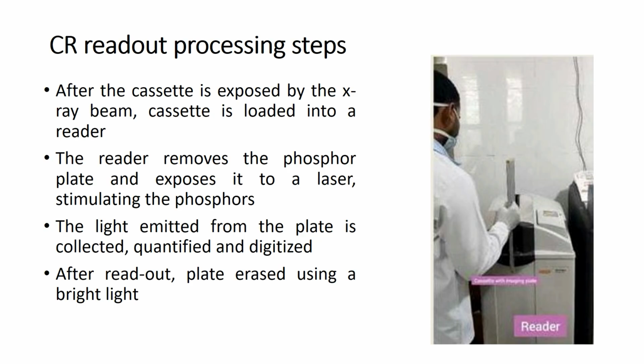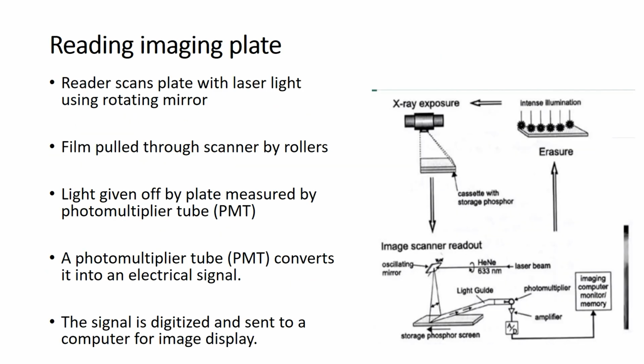After readout, the plate is erased using a bright light, so that you can use that plate again for the next imaging.